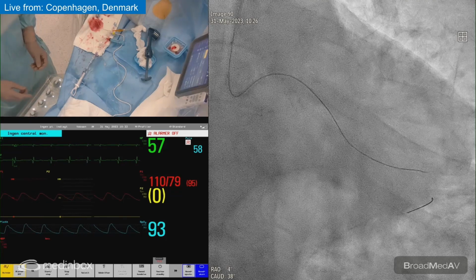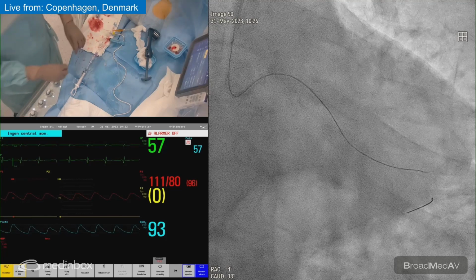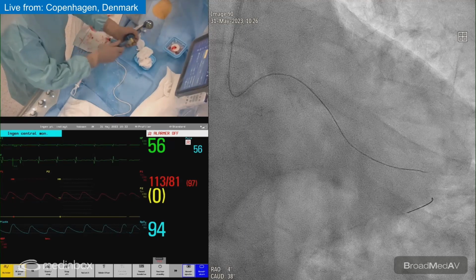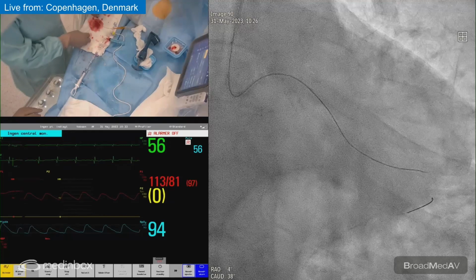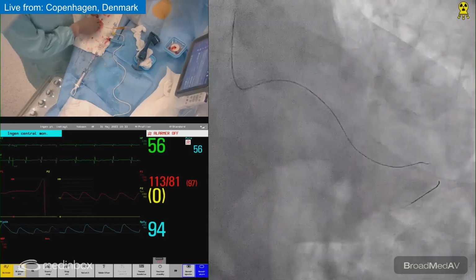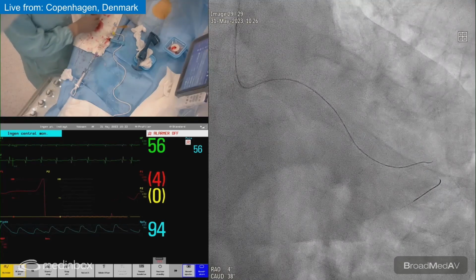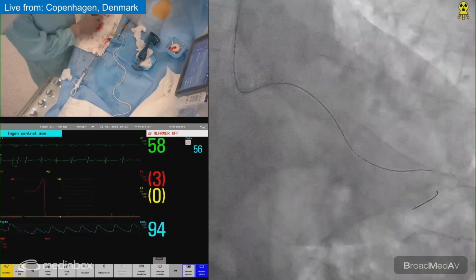Okay. So that means that the next step will be changing the fielder XTA in the marginal branch. We'll go down, bring up the trapper balloon, and then just go down with the turnpike spiral, and bring out the fielder XTA.